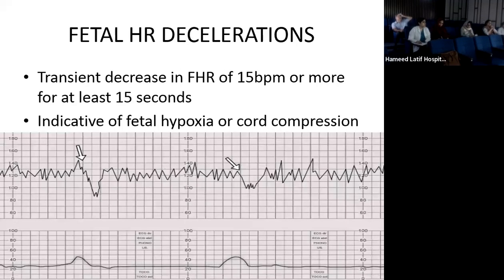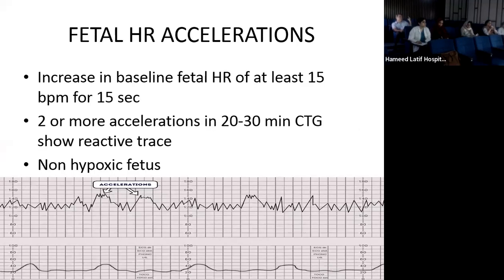Acceleration done. Yes, Mr. Patel. What do you think causes an acceleration? Nutrient consumption. Fair. Fetal movement. Well done, fair. And then what happens? Catecholamine is released. It stimulates the ANS.